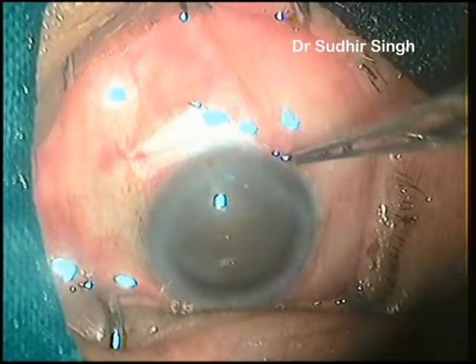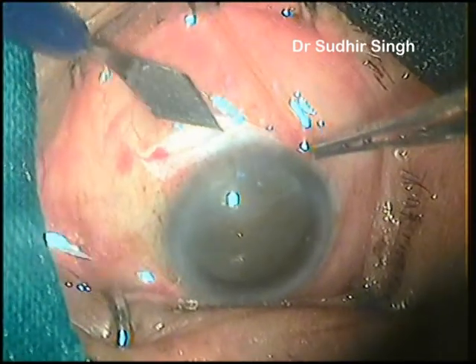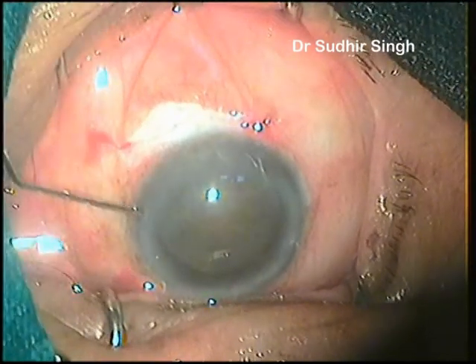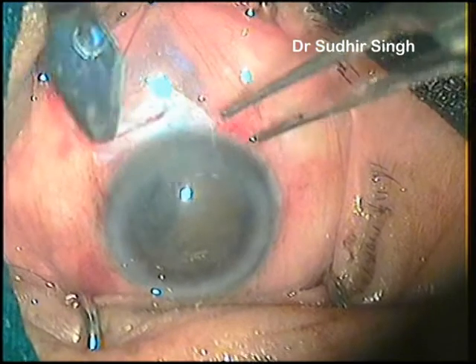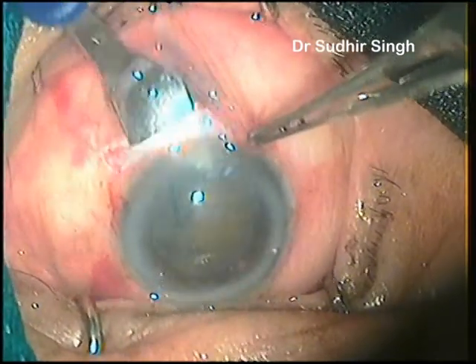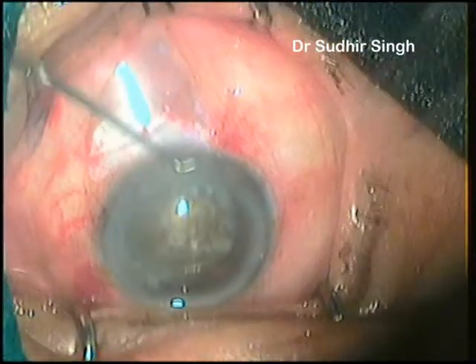The anterior chamber is entered with a 3.2 mm keratome. The capsular hexis is made with a 26 gauge needle cystotome. The internal tunnel opening is enlarged to about 8 mm by a 5 mm keratome.